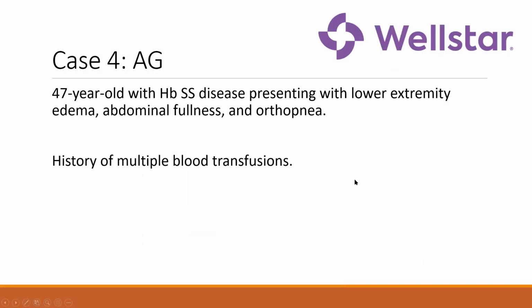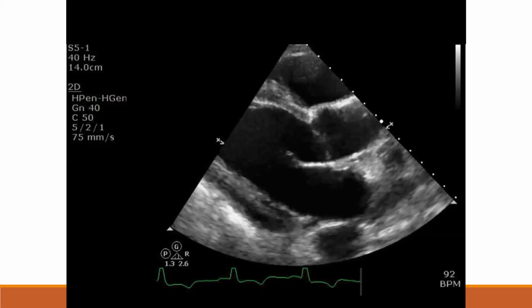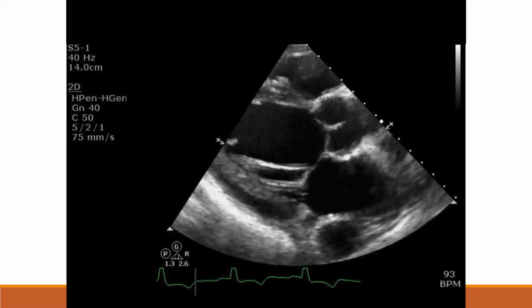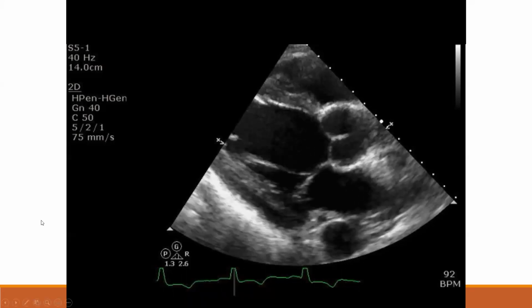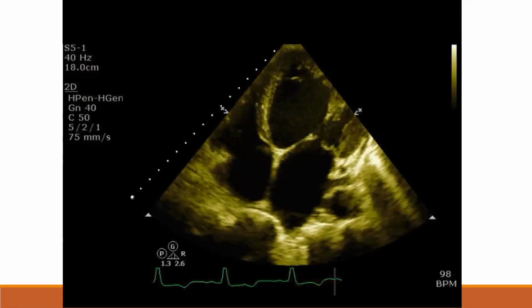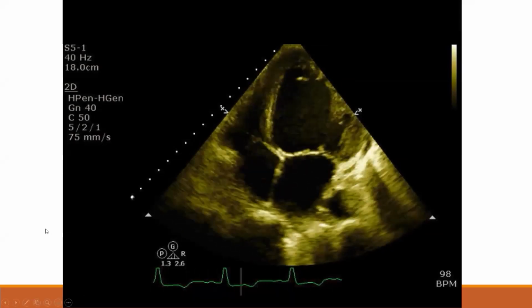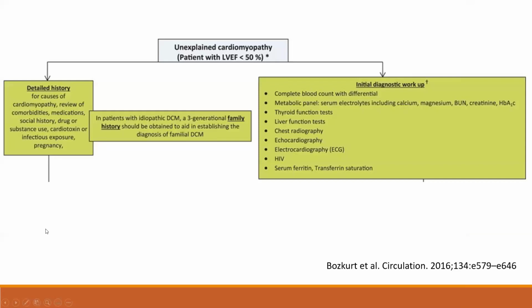Case 4, this is another patient with sickle cell anemia who presented with lower extremity edema, abdominal fullness, and orthopnea. The patient had a history of multiple blood transfusions throughout their life. You can see this patient has a cardiomyopathy with reduced LV systolic function, no hypertrophy, and I don't have a measurement here, but just visually you can tell that the left ventricle is quite enlarged. So this patient has a cardiomyopathy.